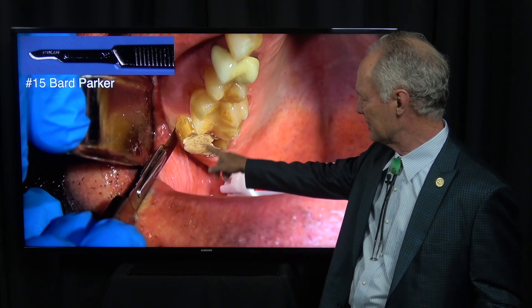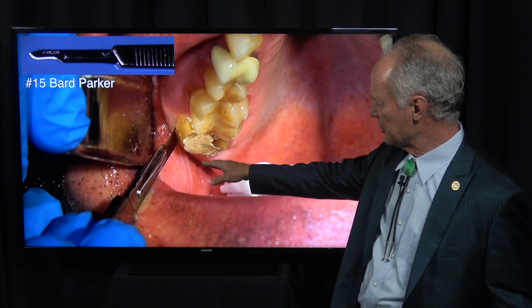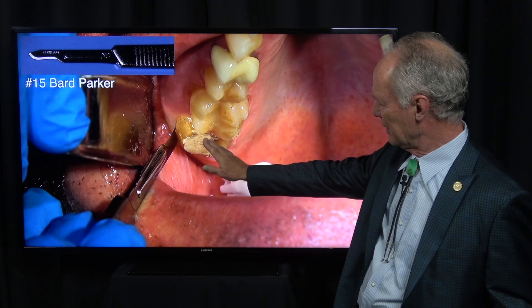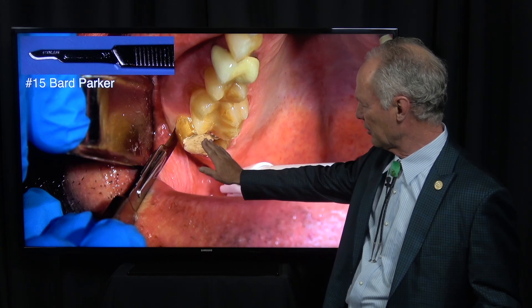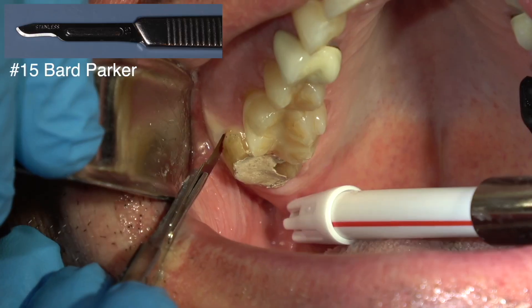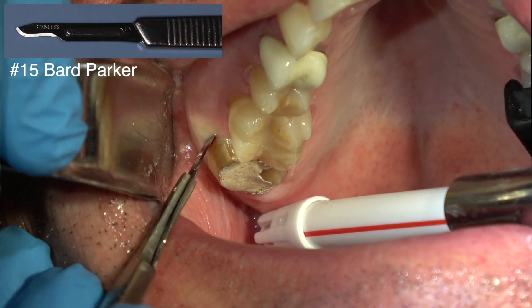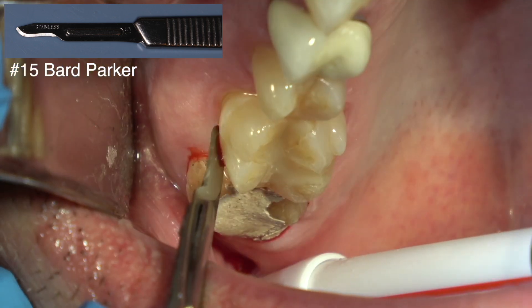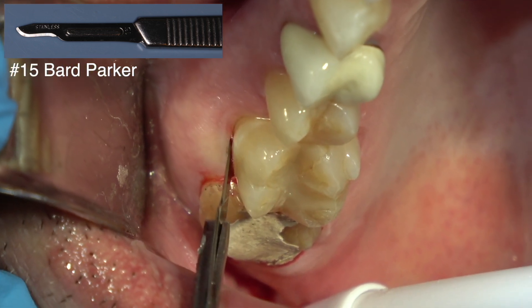This is the tooth. You can see we had an old restoration on the tooth that had broken down, it had leaked, and the whole coronal part of the tooth had been undermined with decay, so there was no saving the tooth. I'm making an intrasulcular incision with this 15-blade Parker. Since I'm going to place a graft, I know I want the flaps to come up as close as possible once I've grafted it.